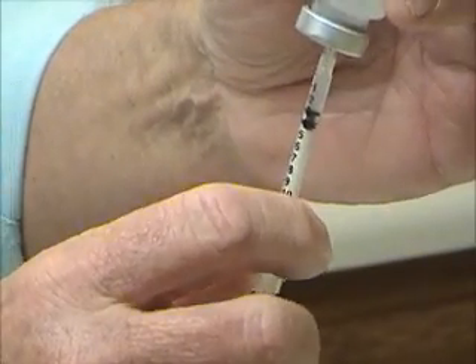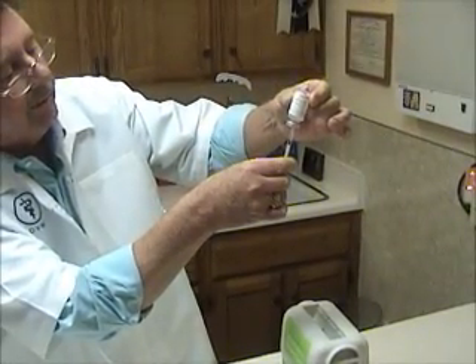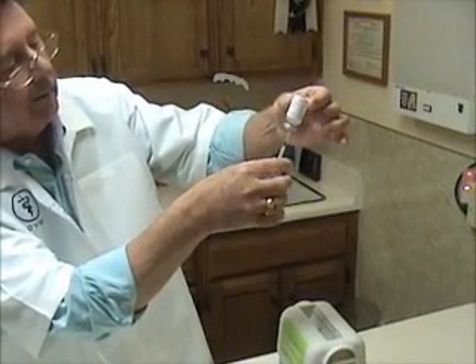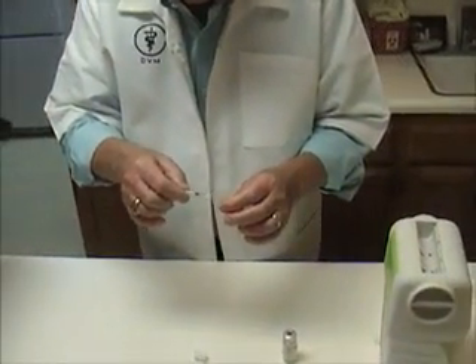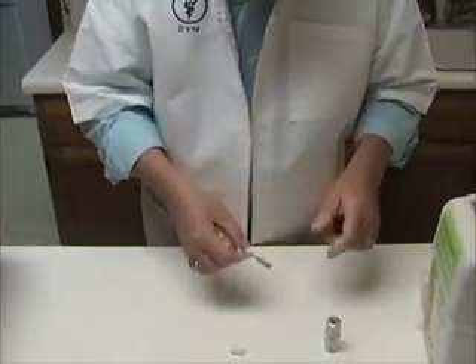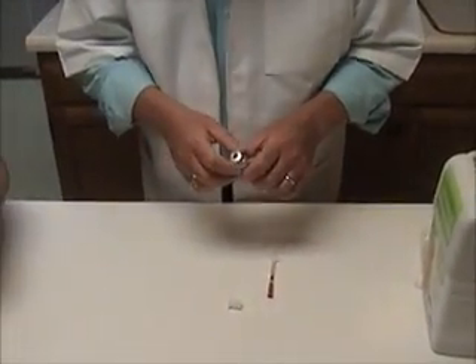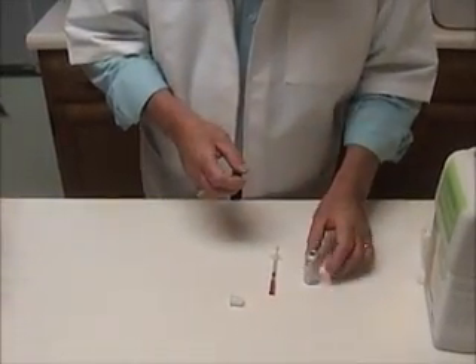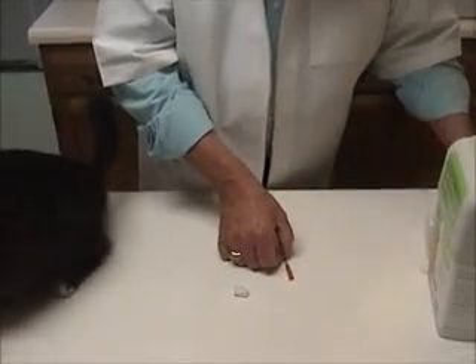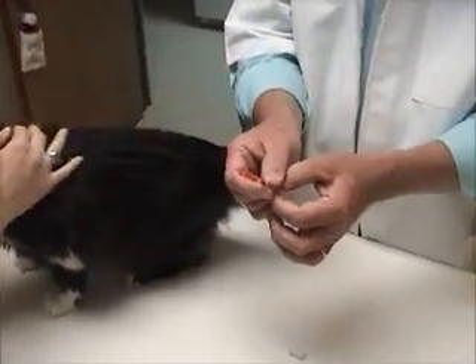Sometimes there will be a little bubble in it. And just like the doctors do on TV, you can kind of tap it a little bit like that. If you get an air bubble, you can take out a little bit of extra and push that air bubble back in. Then we are going to recap our needle. This is very much a discouraged practice in human medicine because of hepatitis and AIDS transmission, but obviously with animals we're not concerned about that. So we've got Sweetie's shot ready to go — just three little units of U40 insulin.